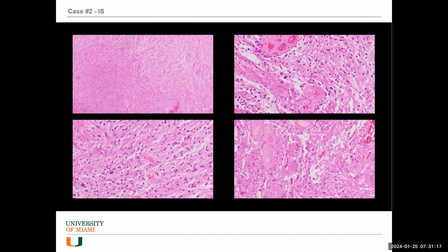It's a variably cellular lesion. On the left upper, you can see the left side has denser, right side has looser areas. So that's one typical appearance for JPA. On the pictures that follow on the right side upper, again, you start to notice the fibrillarity of the cells. On the bottom left, again, these elongated cell processes of pilocytic cells.